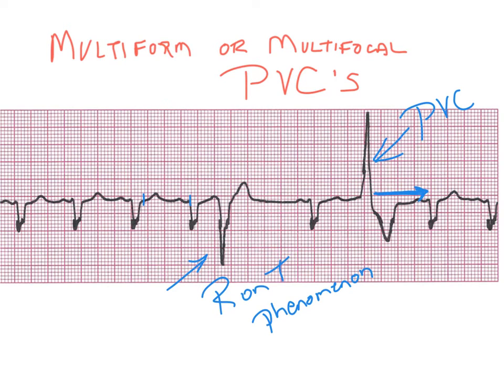So a compensatory pause, when you're looking for premature ventricular contractions, comes early with a compensatory pause. You won't see the compensatory pause with your escape beats. I hope this helps a little bit. We're going to show a few more of these. Just giving you a quick overview for you to go back and look at.